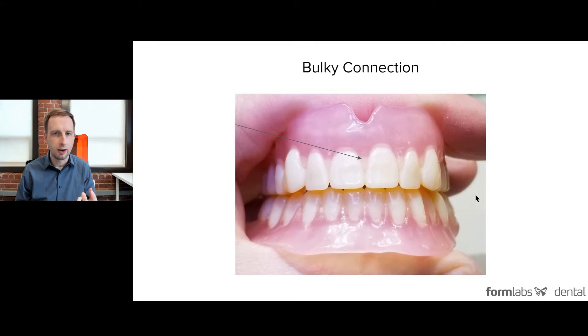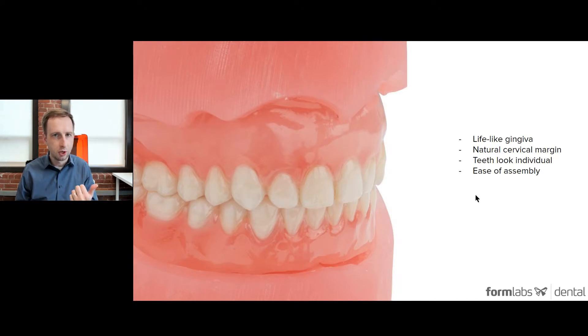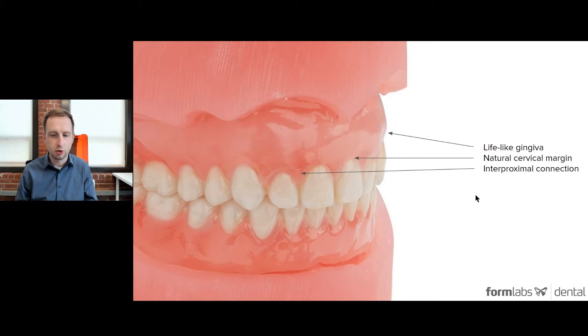How do we deal with that and get a better result? It really breaks down into four main components: lifelike gingiva, a natural cervical margin, the teeth looking individual in construction, and achieving this with ease of assembly and process overall. You can see here the natural cervical margin and interproximal connection — we are producing some pretty good looking 3D printed dentures, especially for having monochromatic or one-color teeth and base material.